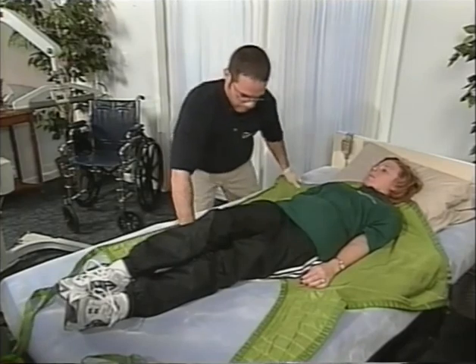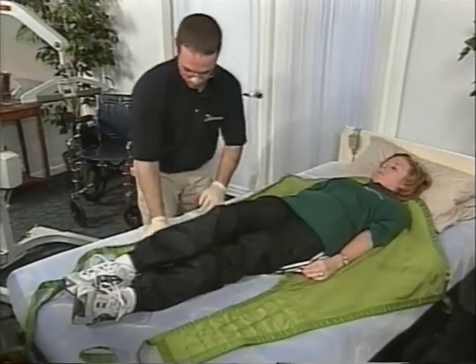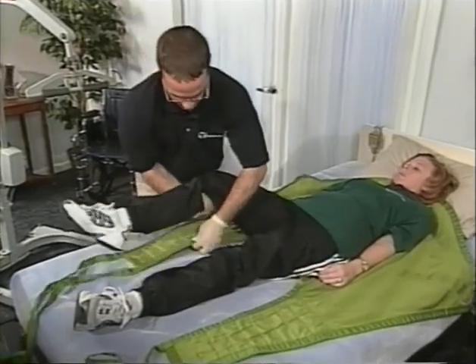Tuck the leg portions of the sling around the client's hips and bring the long portion of the sling underneath each leg.